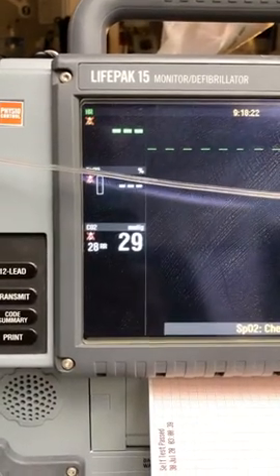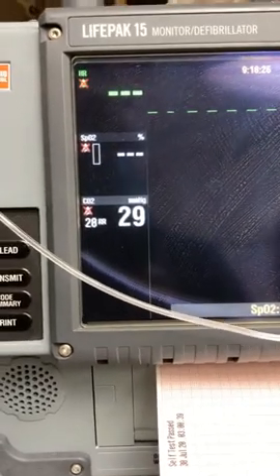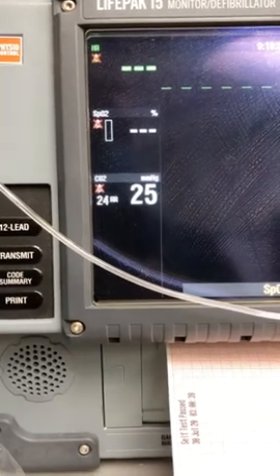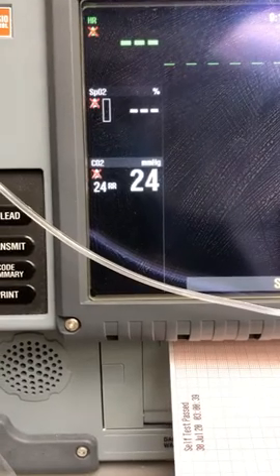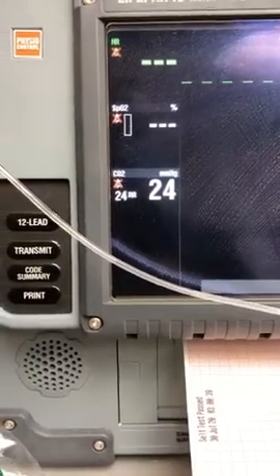Let's go up to the manufacturer's limit, which they say is 5 liters per minute. You can see it drops. I'm not hyperventilating — I think what's happening is, as we go up on the flow rates, the CO2 gets washed out a little, so your CO2 reading becomes a little more inaccurate.